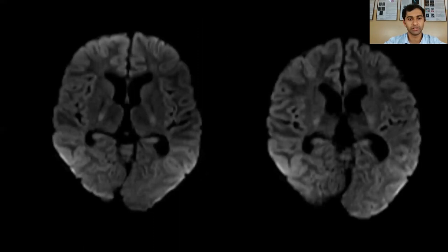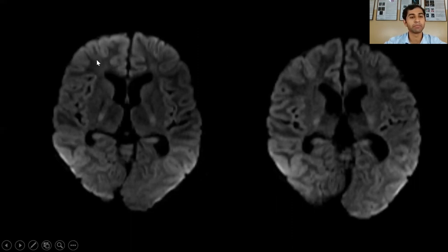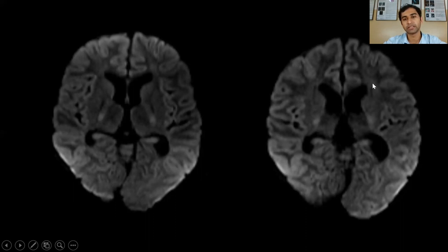This is another case of a 16-year-old male patient with a history of status epilepticus. The initial imaging showed areas of hyperintensity on the DWI image. The follow-up imaging done 4 days later shows that these hyperintensities have disappeared.